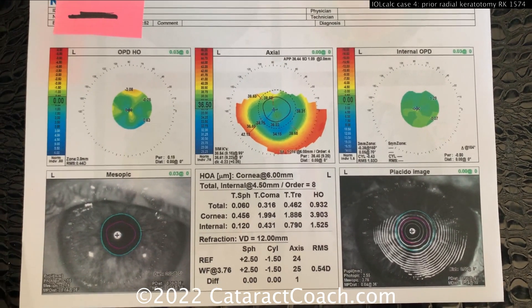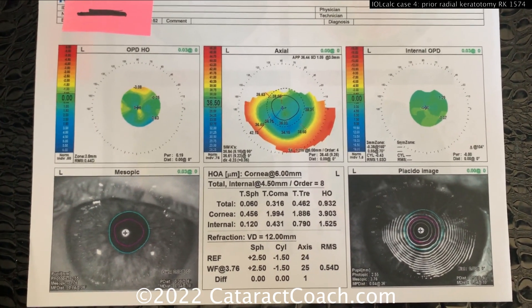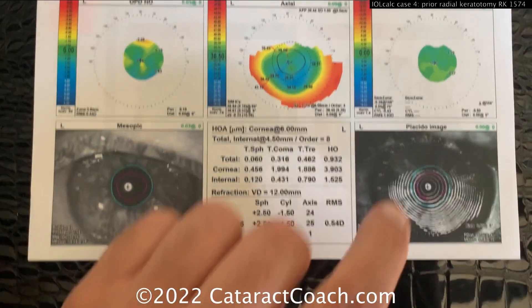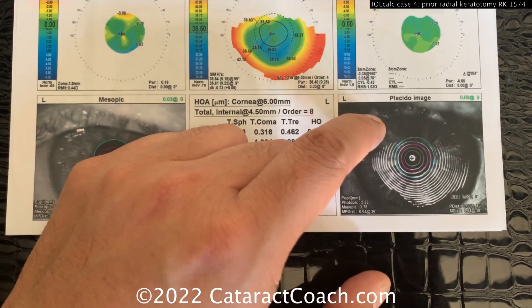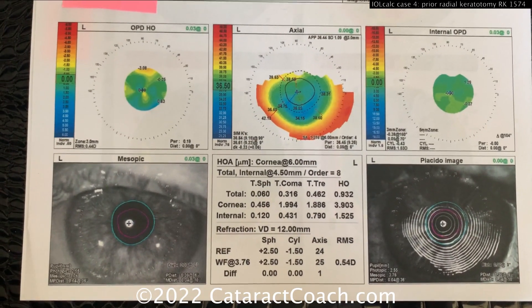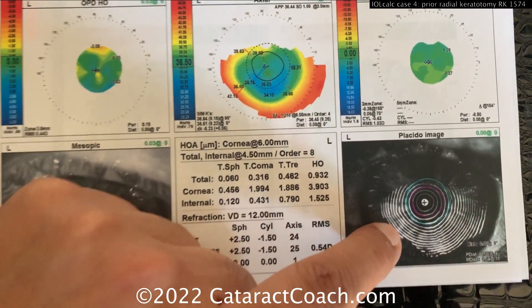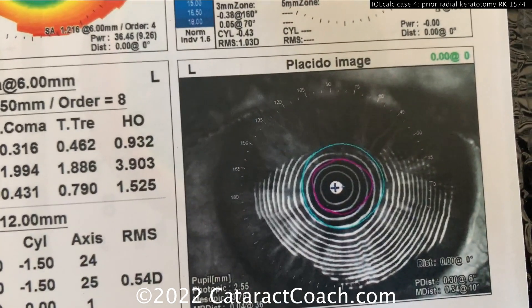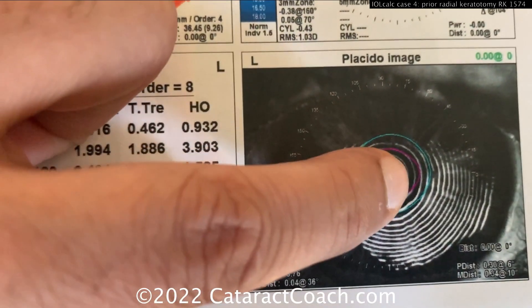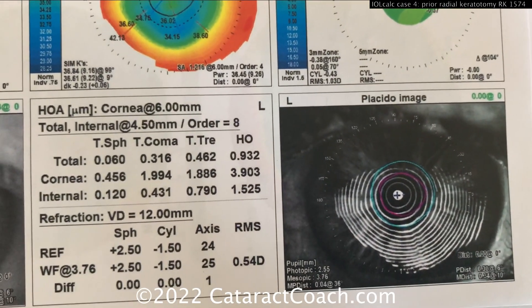Now back before LASIK, radial keratotomy was a common technique used for keratorefractive surgery, typically for myopic eyes, making radial cuts in the cornea in order to flatten the central cornea, lowering the corneal power. Looking at this left eye, you can see a lot of those radial cuts in the topographer reflection — there are actually 22 radial cuts in this eye.